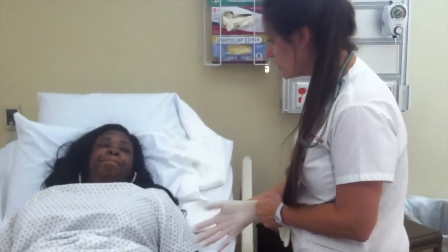If you have any questions along the way just don't hesitate to ask. Cindy, you did good. You were successful at changing your first colostomy bag. How do you feel?